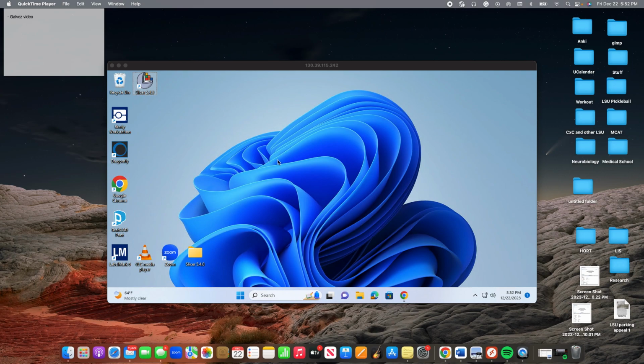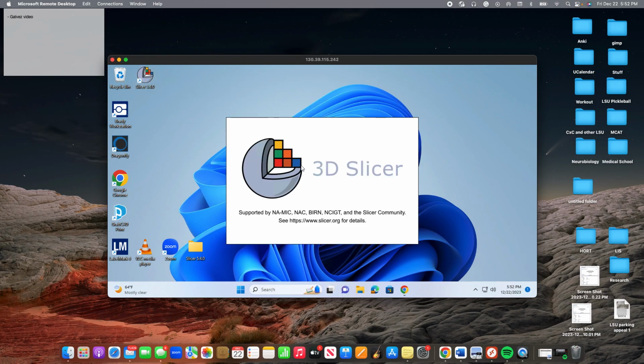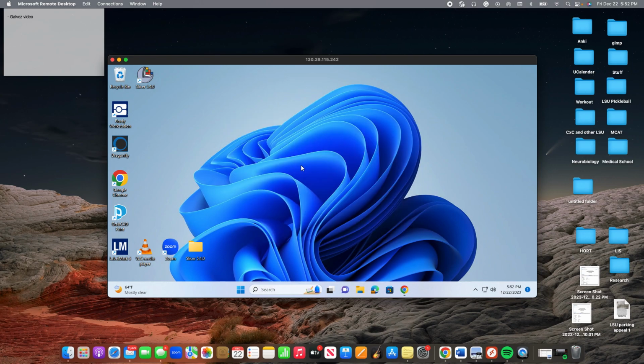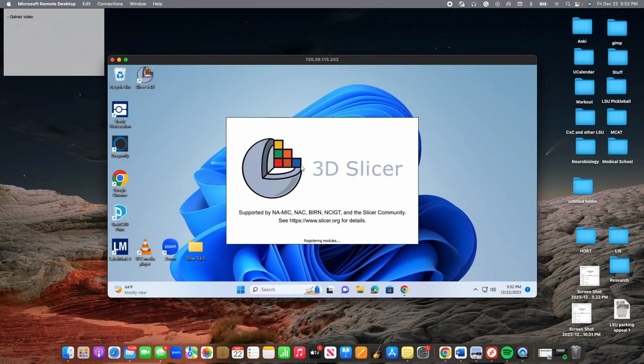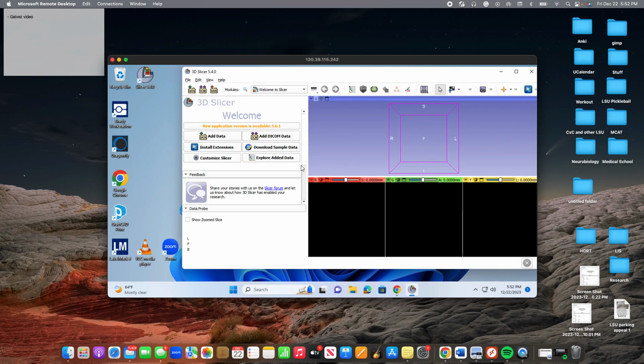All right, so today we're going to be showing how to use CT images of fish, and we're going to be loading them into 3D Slicer to segment their spines. This will allow us to run bone texture analysis on the spines when we want to compare and contrast fish that have been treated with oil or some other chemical to a control group fish. So we're trying to look at how that treatment is going to affect different statistics on their bones or different categories that make up the bone.